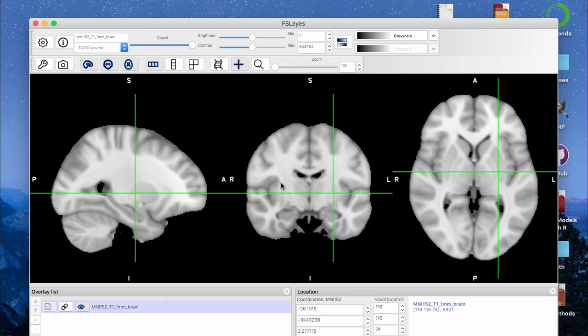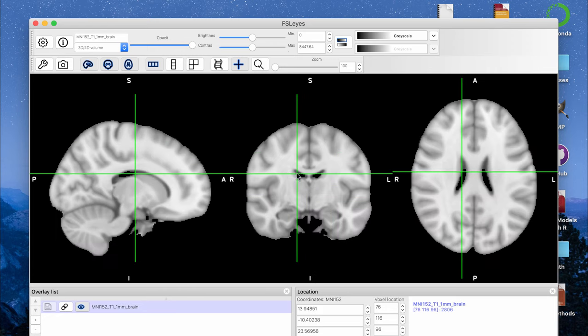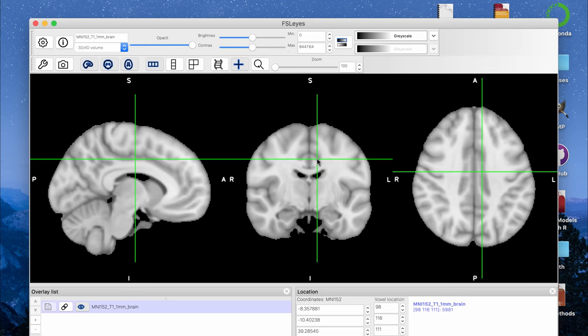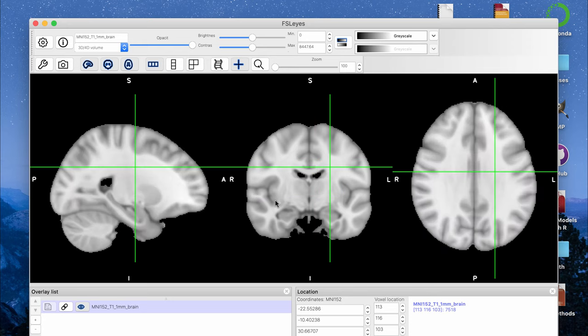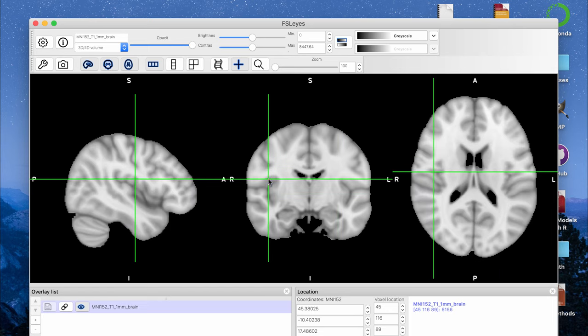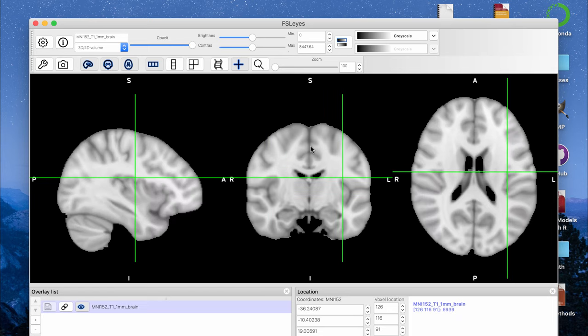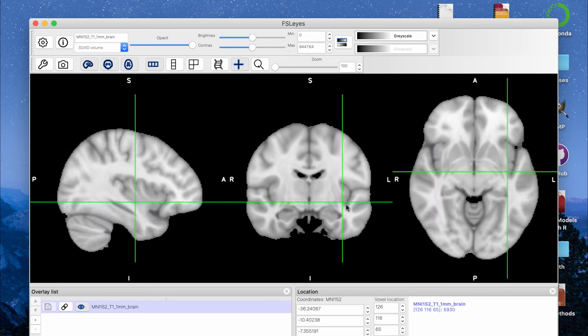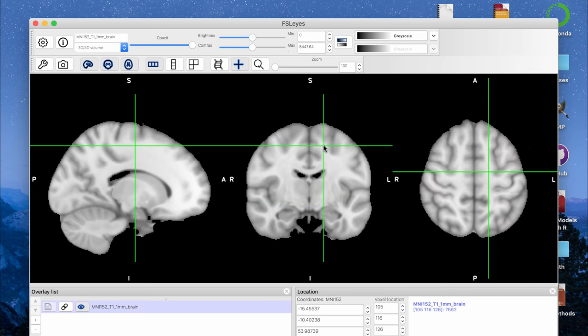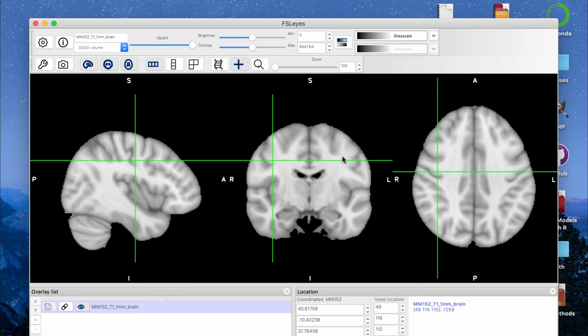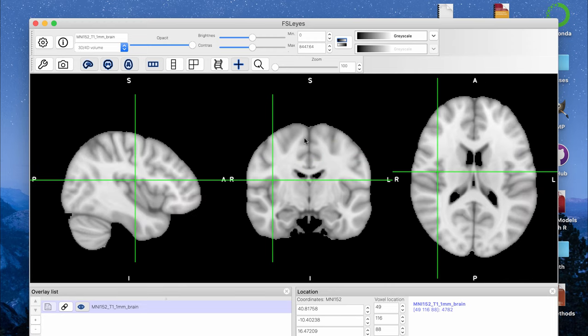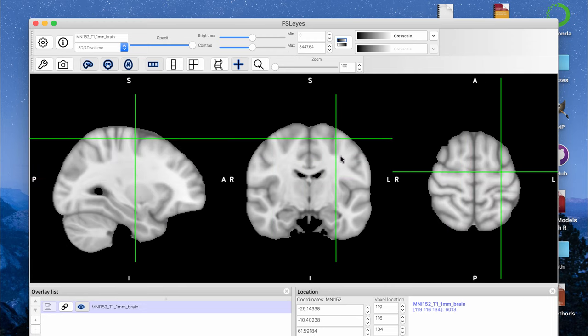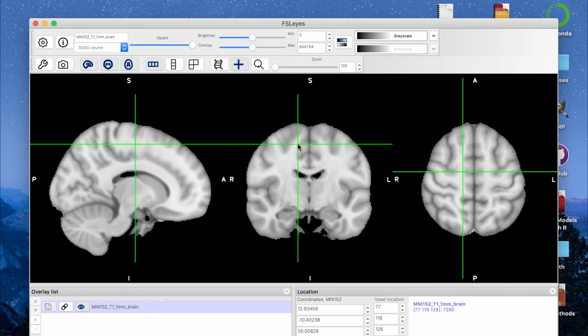When that nifty file is opened, it shows you by default a gray scaled image and if I click on different voxel locations, it gives me the different voxel locations in XYZ coordinates in this window here and I see that each different voxel has a different intensity value which is given here and this produces the different shade of gray that's showing up in the image at each 3D location, each voxel.